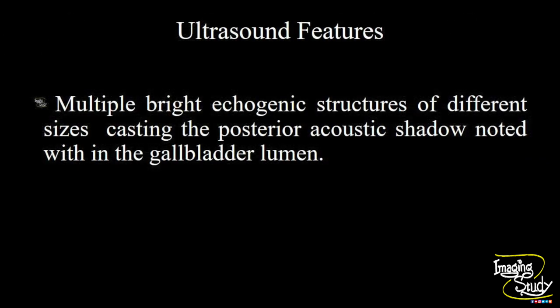So in summary, multiple bright echoic structures of different sizes casting posterior acoustic shadow are noted within the gallbladder lumen.